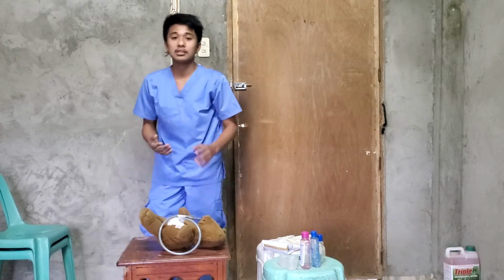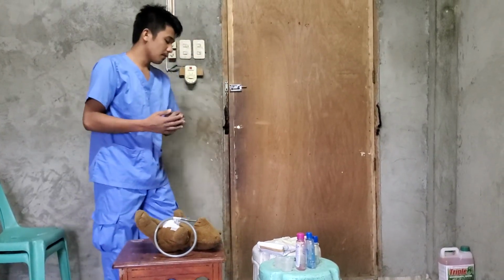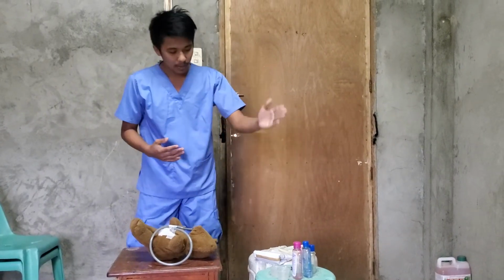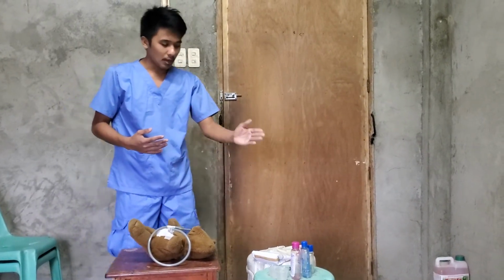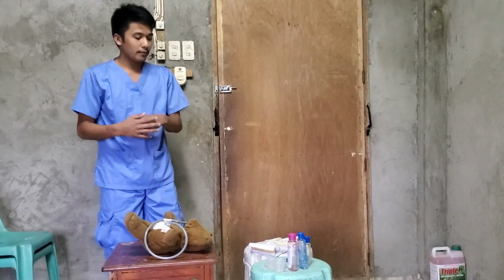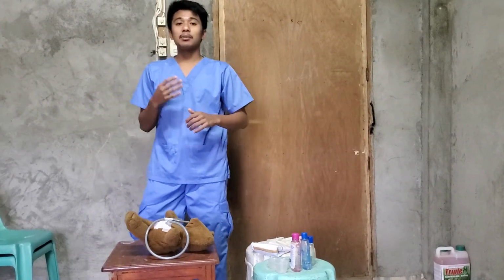Then after that is gather the supplies needed for the procedure. So we have non-sterile gloves, we have a towel, we have tap water, warm water, and we have a syringe, and also we have the prescribed medication. Then after that is the procedure in administering medication.